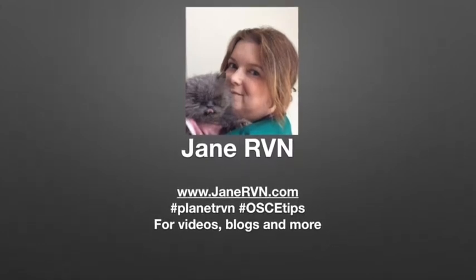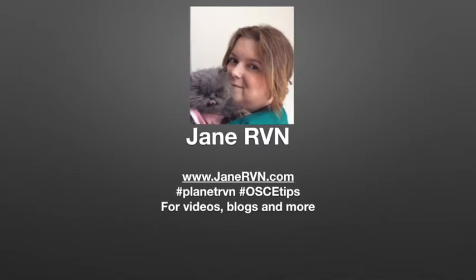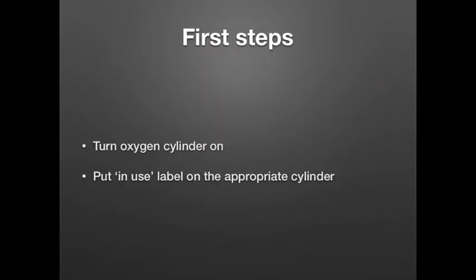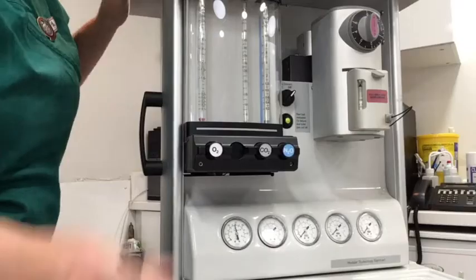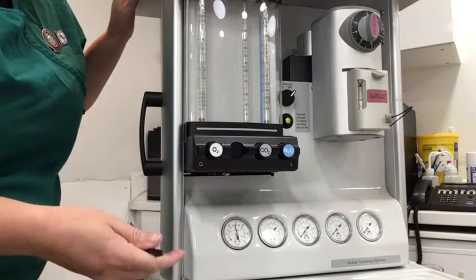Welcome to Planet RVN with Jane RVN, and here are some more OSCE tips. Make sure you carry out your first steps: turn your oxygen cylinder on and don't forget your in-use label on the appropriate cylinder. You can see I have a reading here, so I can confirm that would be enough for my procedure.